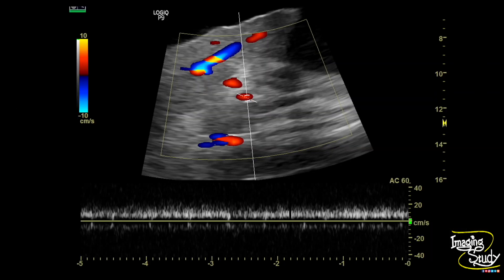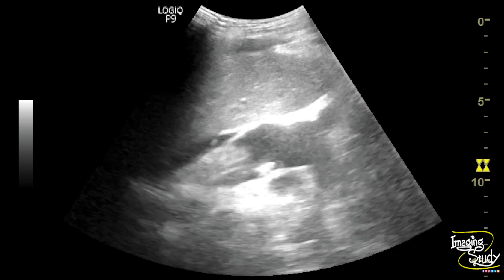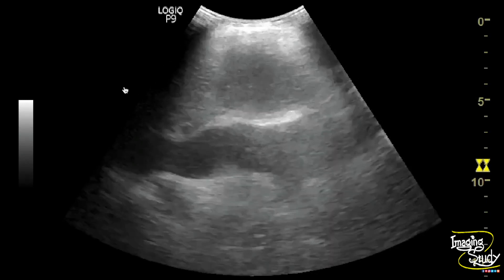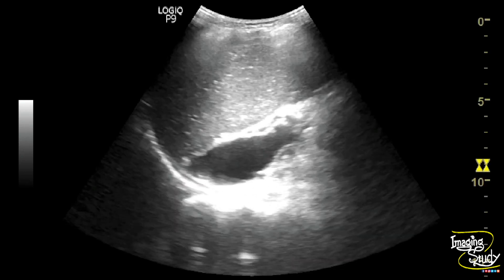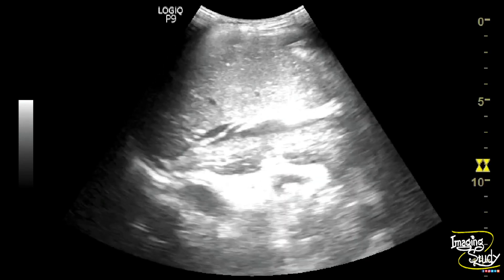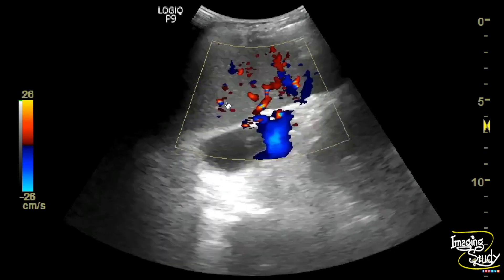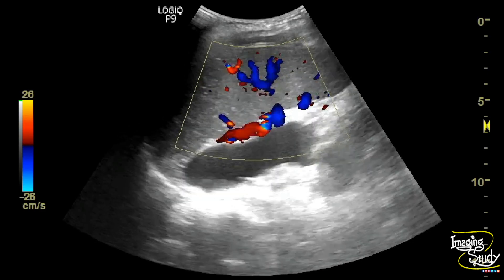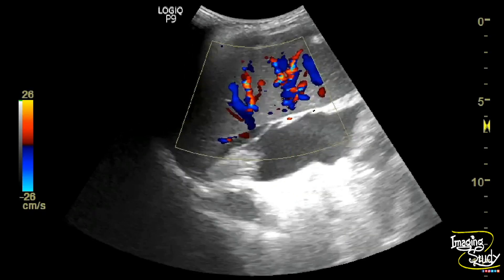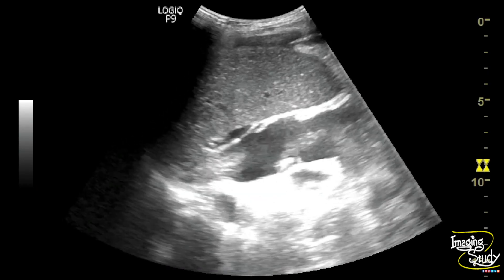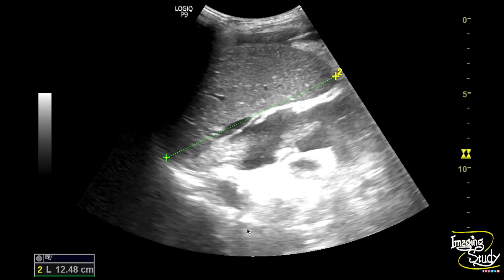Here is the portal venous flow. You can see the enlarged spleen with adjacent ascitic fluid collection. We applied color Doppler and there were no abnormal tortuous vessels at the splenic hilum. The spleen measures around 12.4 centimeters, indicating mild splenomegaly.